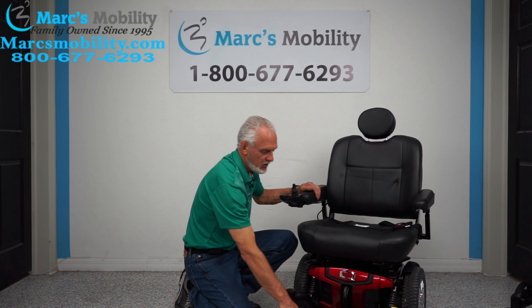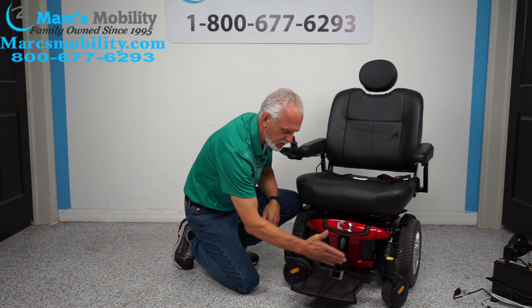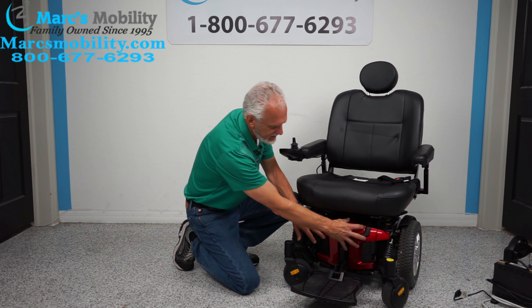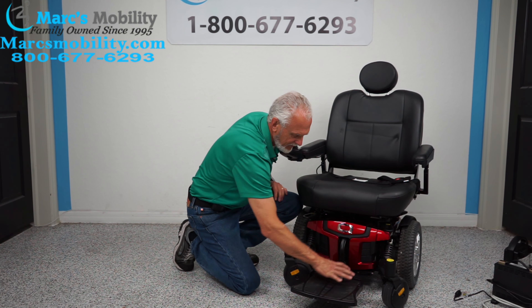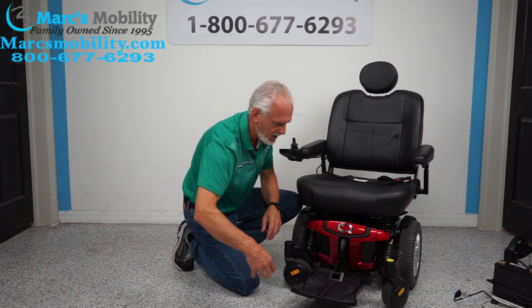You have a foot plate here, it's adjustable. Right now it's sitting out — it can be pushed back two or three inches. The batteries come out from the front. There's two batteries, there's two levers, one on each side. Squeeze the levers, grab the foot plate and this red part — all that will come off and you can pull the big batteries out of here.